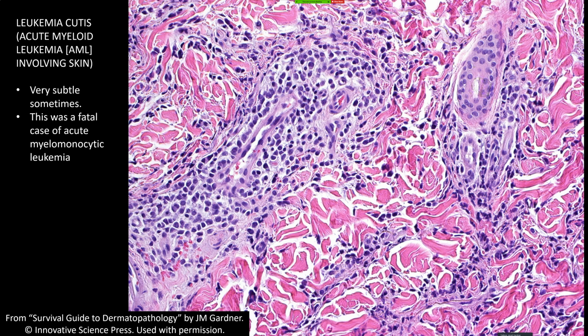mentioned earlier. Sometimes you can have large scattered cells in the dermis that are reactive fibroblasts or myofibroblasts, like in the setting of granulation tissue and other reactive things. So there's a variety of benign things, but when I see big cells that are a little atypical in the dermis, I generally like to find out what they are.